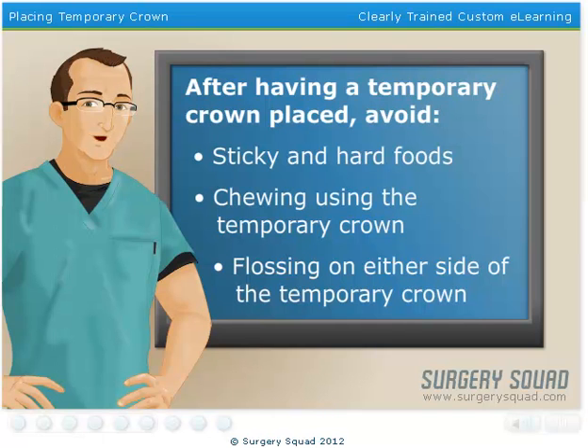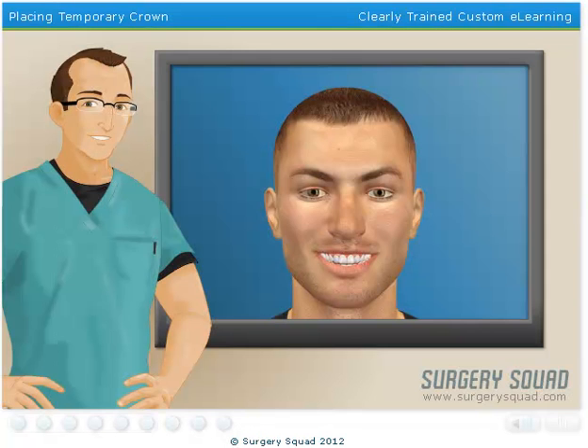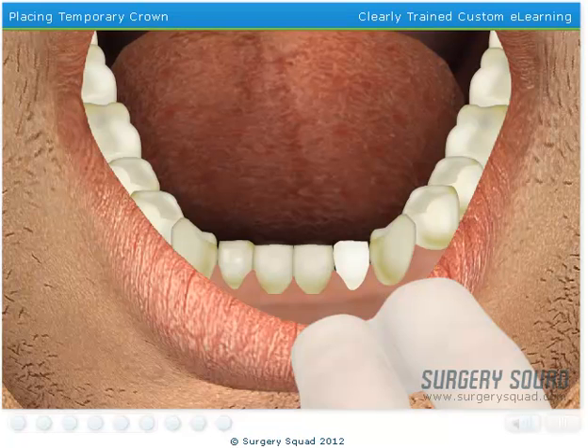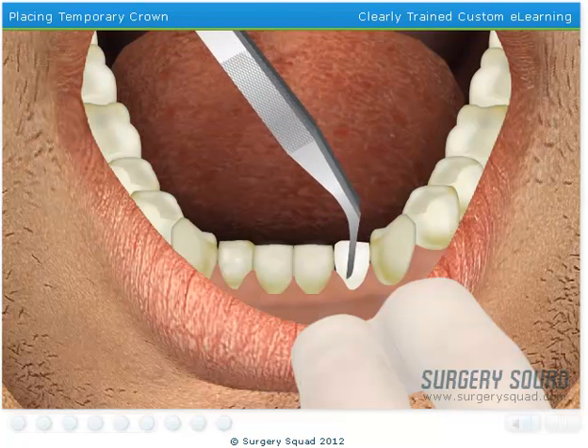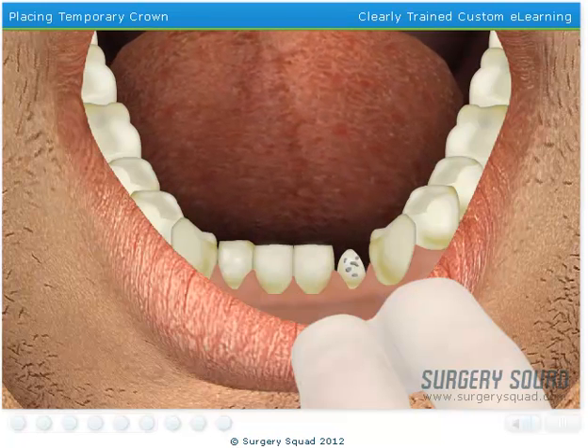We've done all we can do today. Our patient will need to come back in a week to have their permanent crown placed. Welcome back! Our patient has returned and is ready to have their permanent crown put on. Begin by using the dental hemostat to remove the temporary crown that we placed on the tooth last time. Now use the explorer to remove any excess temporary cement and debris.